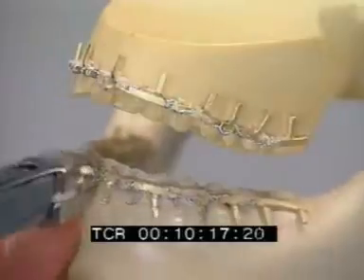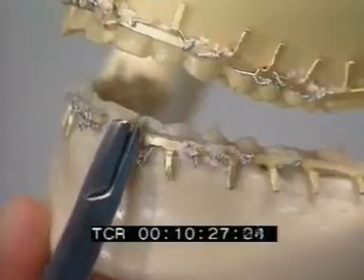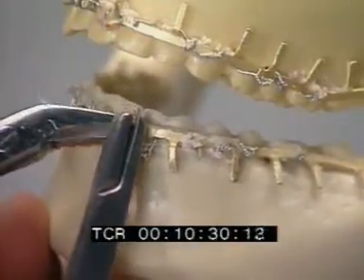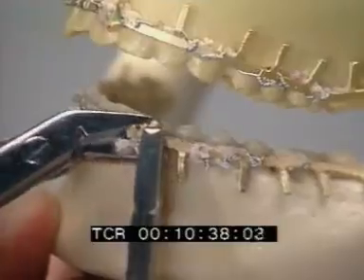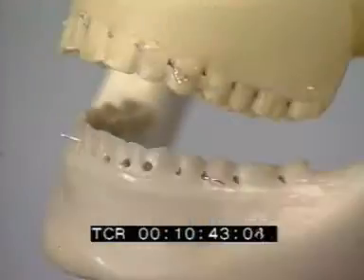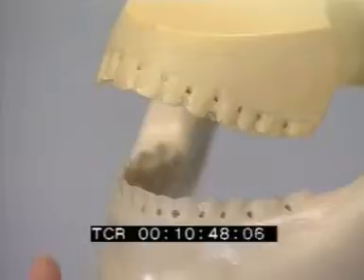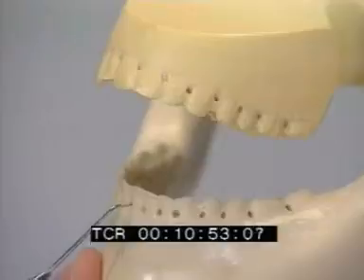The bar is cut near the midline and then turned back on itself, like opening a sardine can. This exposes each wire in sequence so they can easily be cut. The remaining wire fragments are carefully removed. A dental probe is used to make sure that all the wire fragments are gone.